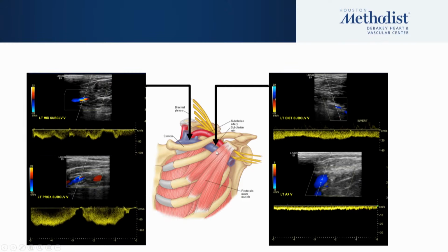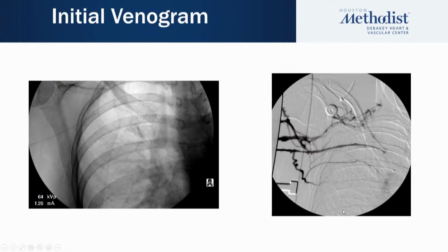And we discussed this earlier in one of those examples where we see continuous waveforms on the venous study in the subclavian, as we see here. So this is on the more proximal subclavian. You see sort of a phasic flow, but then in the thoracic outlet or lateral to the clavicle, we see how in the subclavian axillary vein, the flow is more continuous, suggestive of central obstruction.